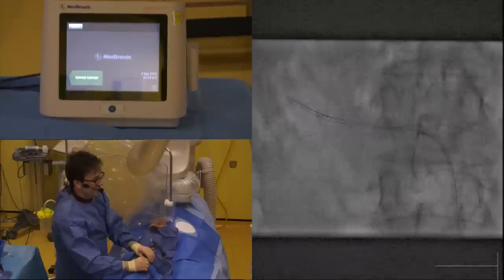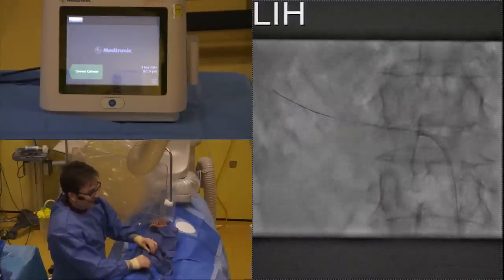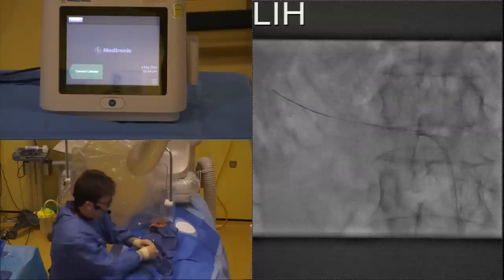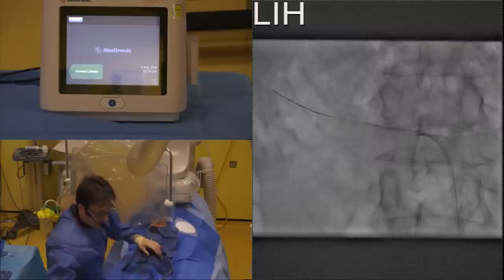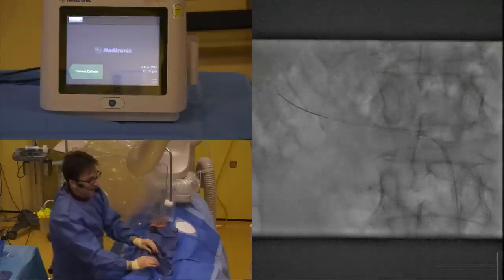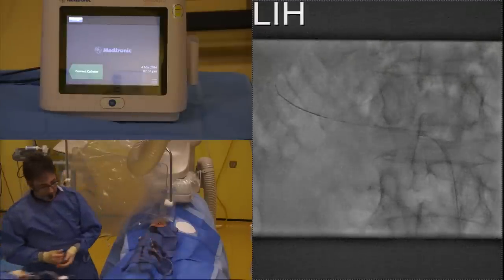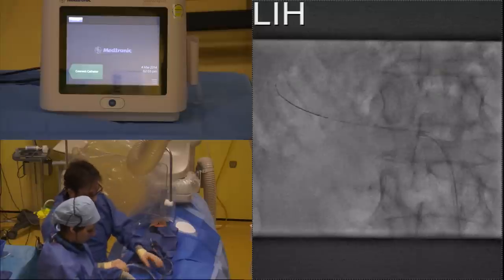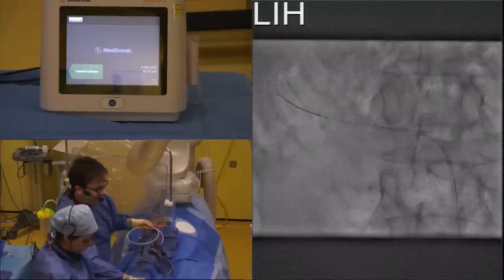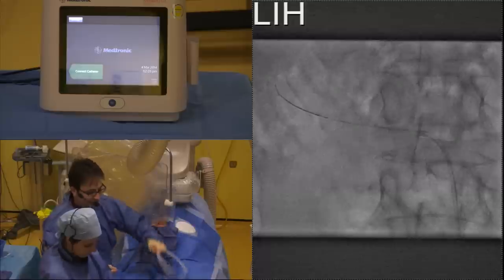This is a lovely case. Distance to where you can apply your ablation and very straight. Absolutely right. Let's hope we're not tempting fate, but as you say, it's a nice straight vessel and the rail went in easily. The other case technically had a few challenges with regards to the anatomy, but this, from a beginner's perspective, is a much more ideal case.